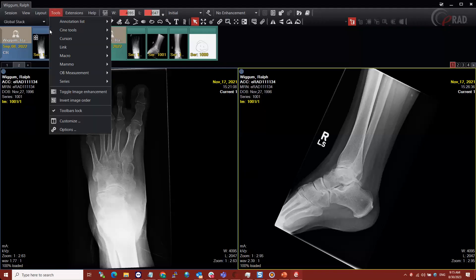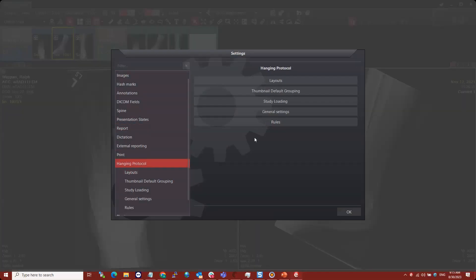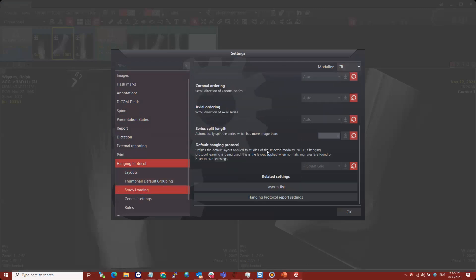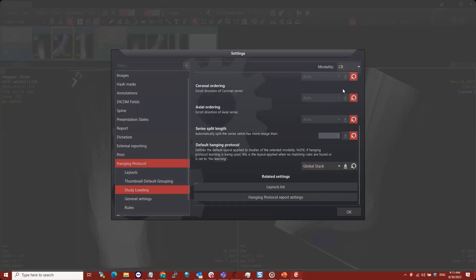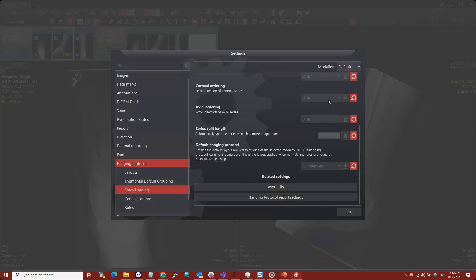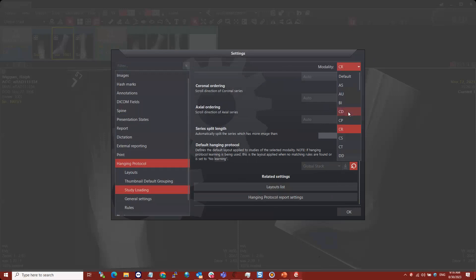I'm going to save this hanging protocol and call it 'Global Stack,' keeping it available for all modalities. Then I'll go to Tools > Options > Hanging Protocols > Study Loading, select CR, and set the default hanging protocol to my new Global Stack. Any new hanging protocol you add always appears at the bottom of the dropdown. I'll also set this as the overall default, so any study that doesn't have an explicitly defined modality protocol will use the Global Stack. I'll also set PET-CT to use 2 by 2.